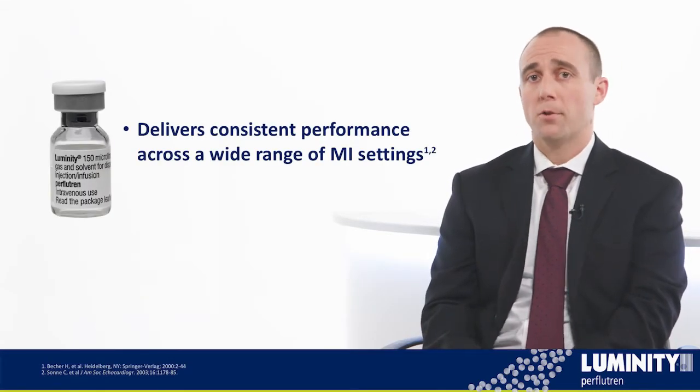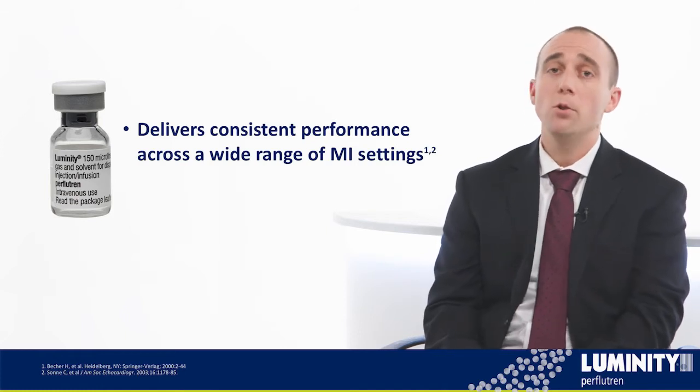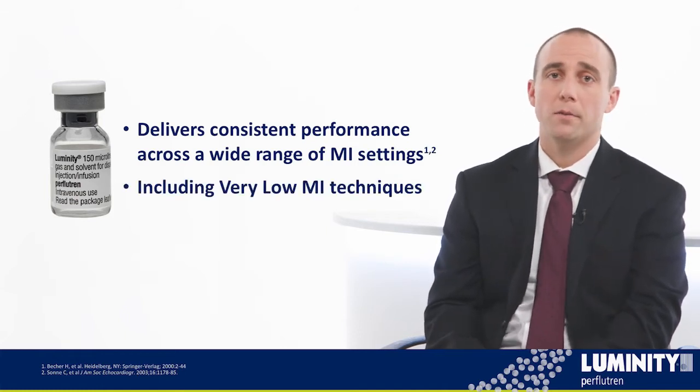It's important to know that very low MI imaging, again, is not just lowering the MI less than 0.2. Harmonic imaging should be used with appropriately adjusted MI settings to meet the imaging needs of each patient. Luminity does deliver consistent performance across a wide range of MI settings, including very low MI techniques.